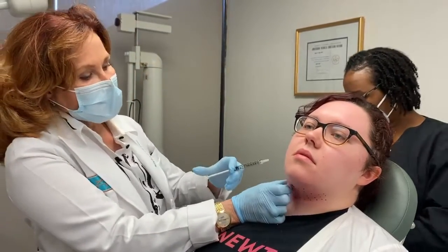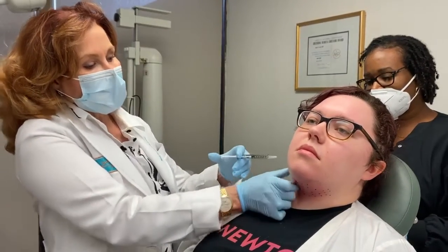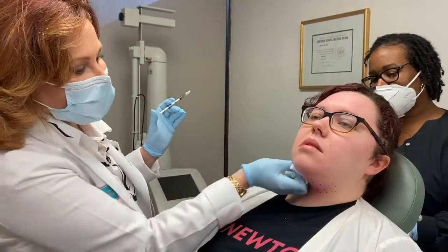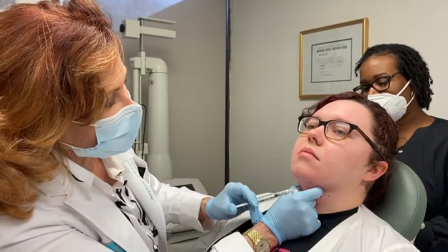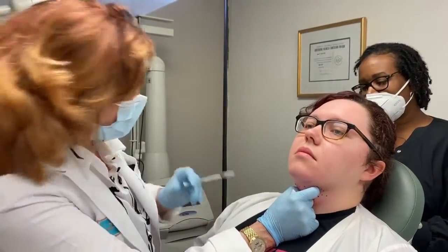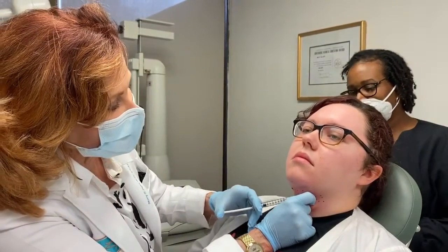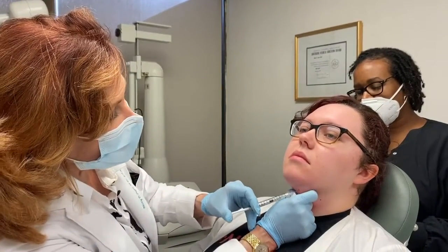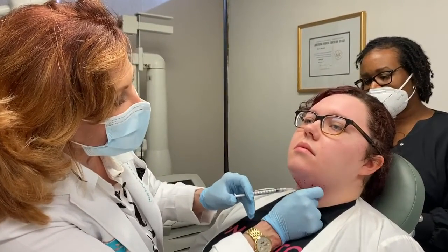It's great to have your assistant hand you the syringes so you don't miss your spot. I usually don't go beyond the sternocleidomastoid in that area, and now we're going to go more centrally over here. The sticks are anywhere from 0.1 to 0.2 cc's, preferably 0.2, and you just want to course it along. Notice I'm not going inside the tattoo — we don't want to tattoo the patient.